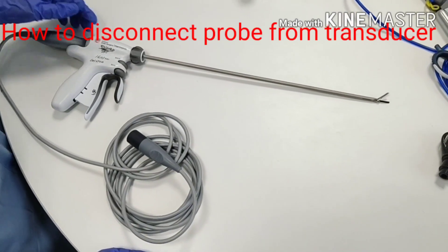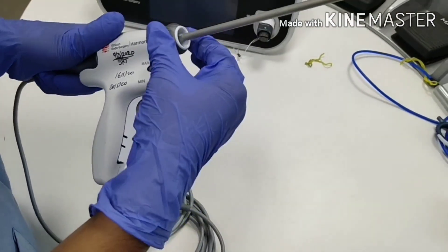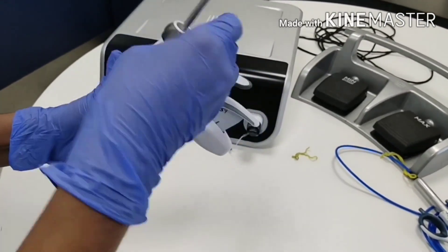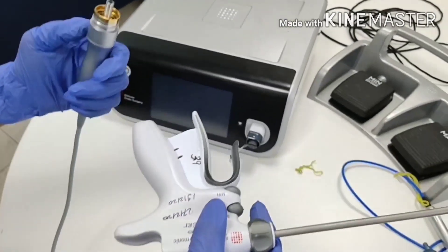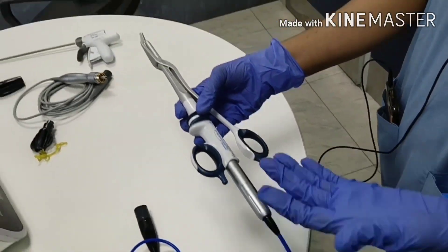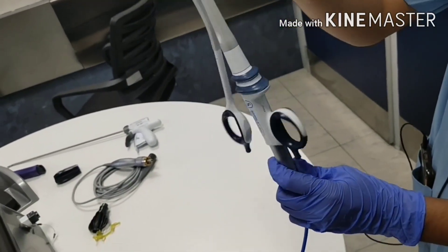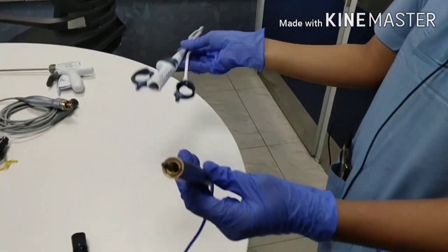Now we will see how to disconnect the probe from the transducer. Hold the transducer and rotate this — anti-clockwise. It will make a click sound. Then rotate further and it will loosen. Remove it. Keep the transducer safe. To disconnect the focus probe from the handpiece, rotate anti-clockwise and unscrew it — it will loosen. Do not rotate the transducer. And it is disconnected.